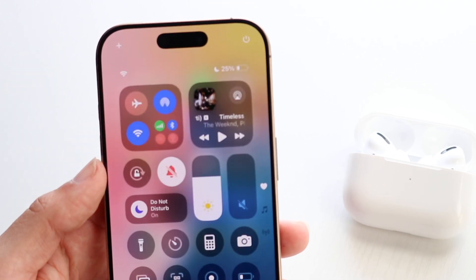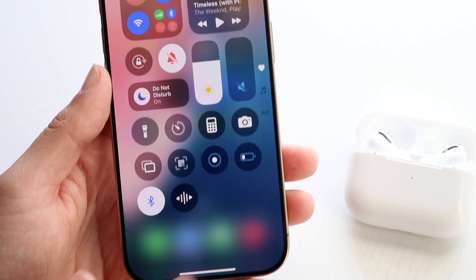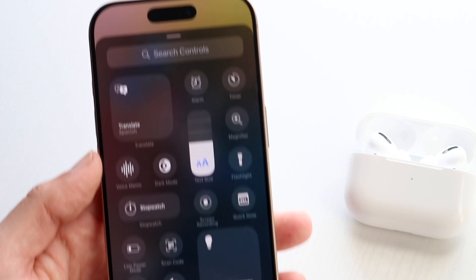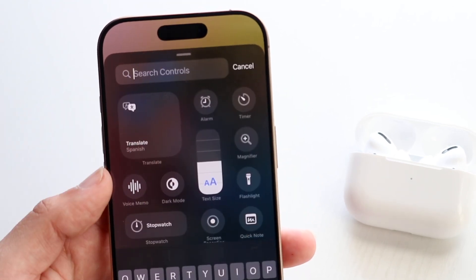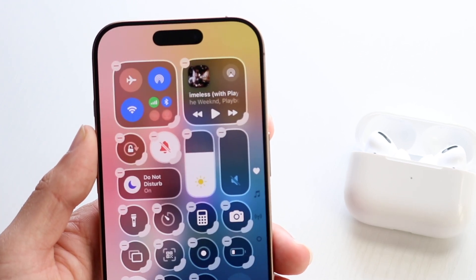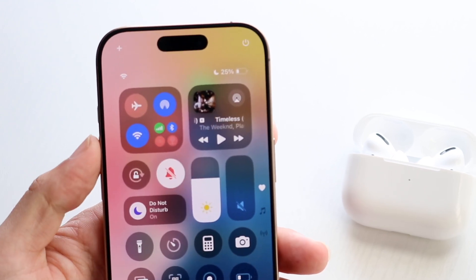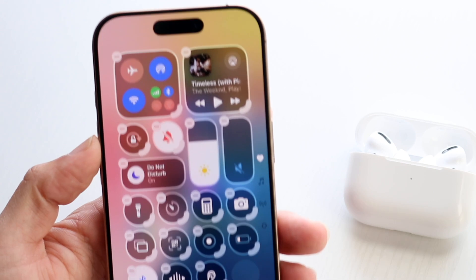You can do this by swiping down from the top right corner of your iPhone to get into Control Center. Hold down to enter edit mode and tap Add Control at the bottom. Search for Hearing — you'll see the hearing option appear. Tap on Hearing to add it. Now you can quickly toggle on or off your speaker, background sounds, and the hearing assistance option as well.